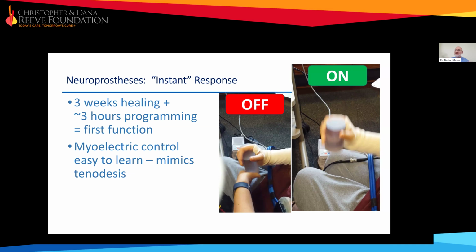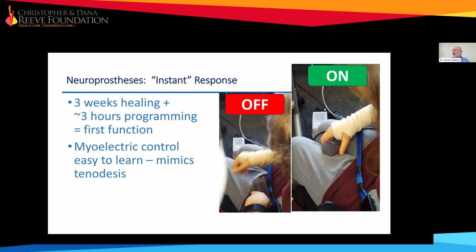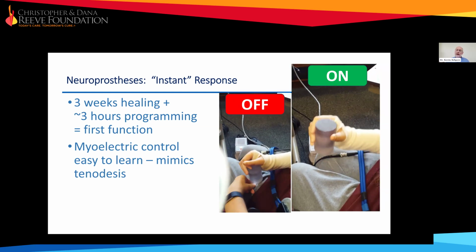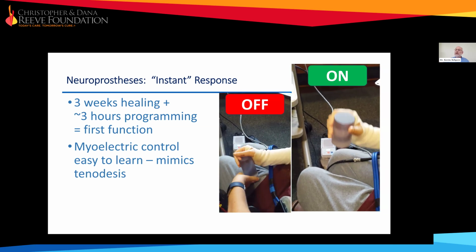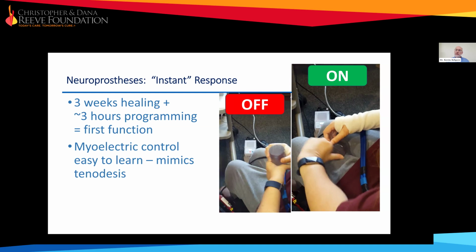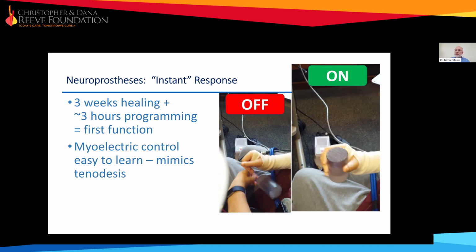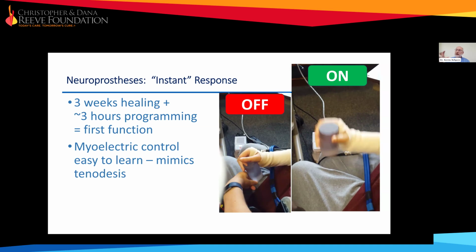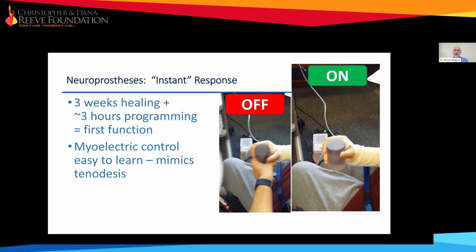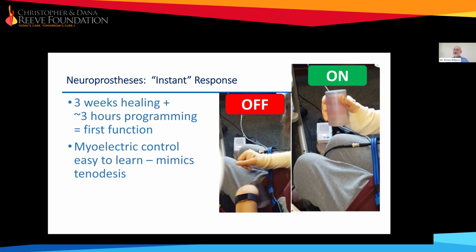And then they go home. We send them home after we've given them some therapy and training. And they go home and they try the doorknob in their house or something like that. And then they come back to us and say, well, I can do a fork and I can pick up a glass, but I have a really hard time manipulating the doorknob in my house. And so then we can start modifying the grasp pattern so that it works well for their specific doorknob, or teach them tricks so that they can learn how to use the stimulation with their particular doorknob to take advantage of it. So it's quick, but it's also probably going to be quite a while to really master the use of the system.